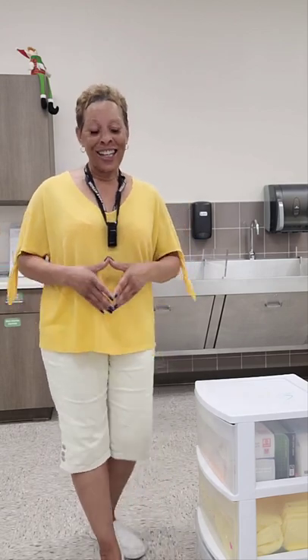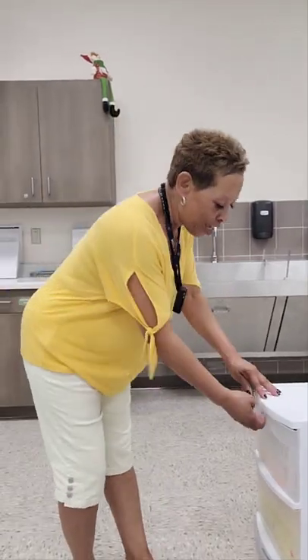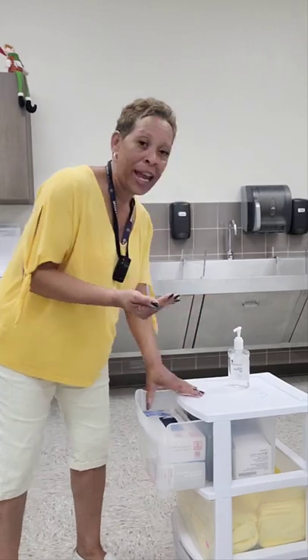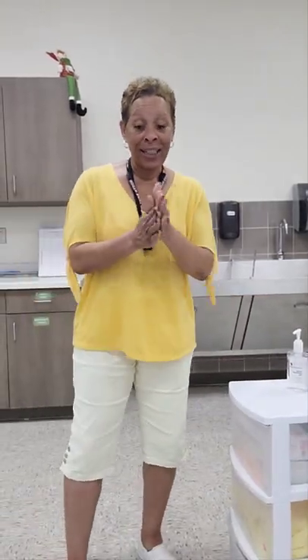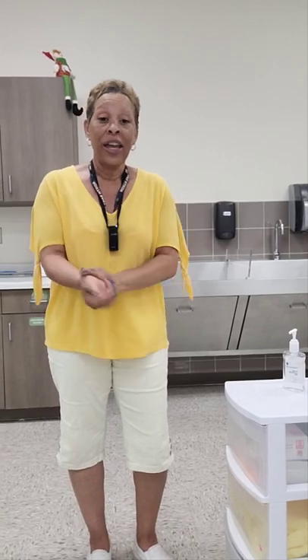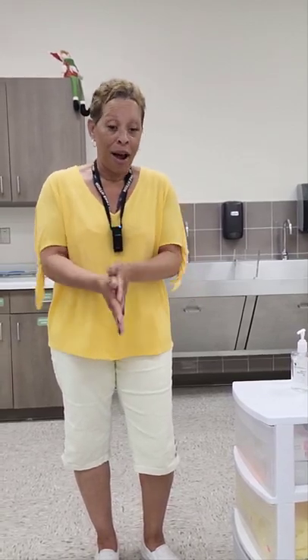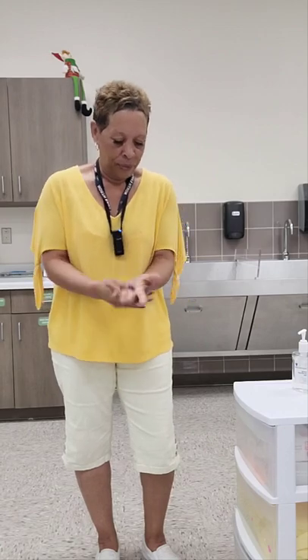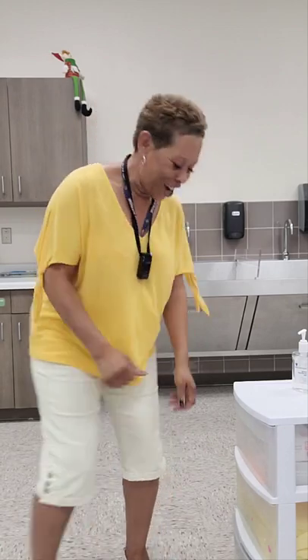So let's go ahead and get started. The first thing you'll be required to do is sanitize your hands with hand sanitizer, and you'll have to rub your hands until they are completely dry. All right, they're dry.